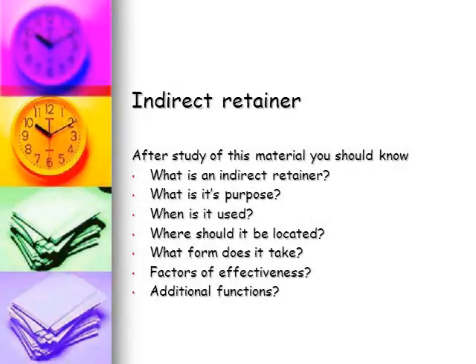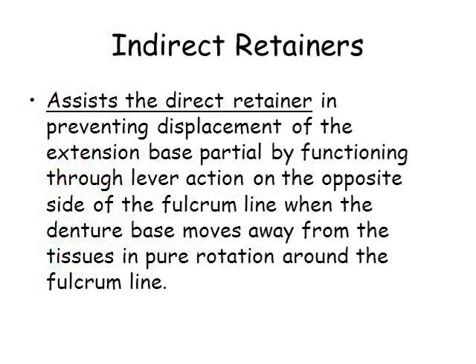The objective of this lesson is to understand the indirect retainer, what it is, when it is used. This slide gives the definition.